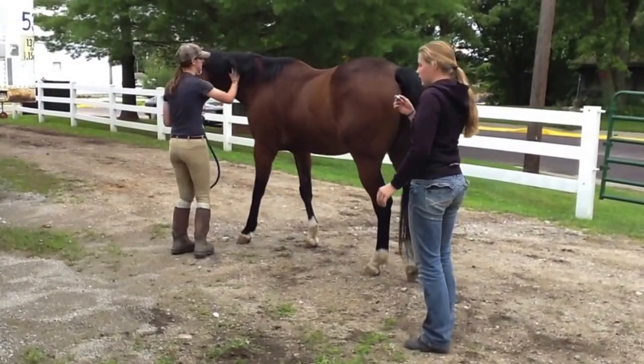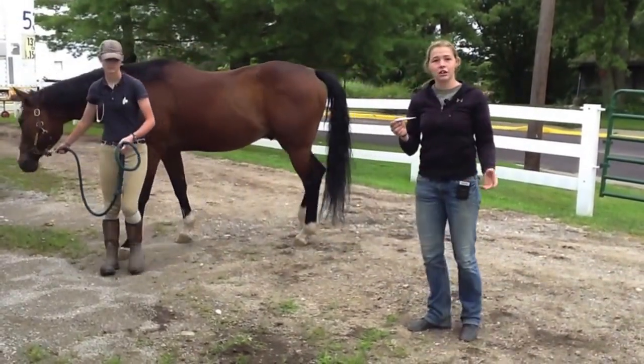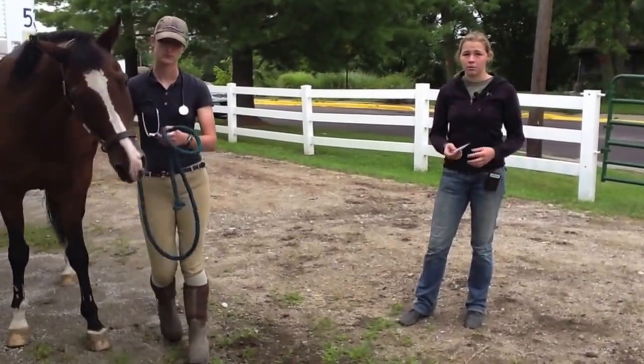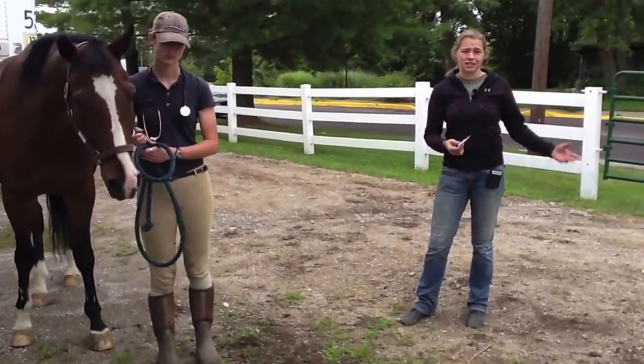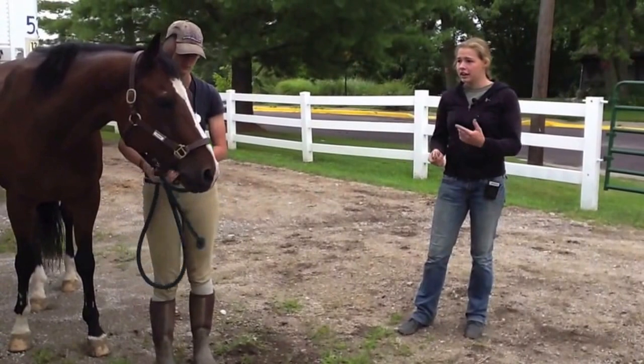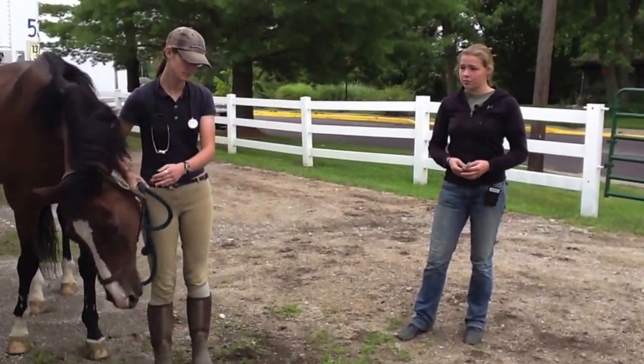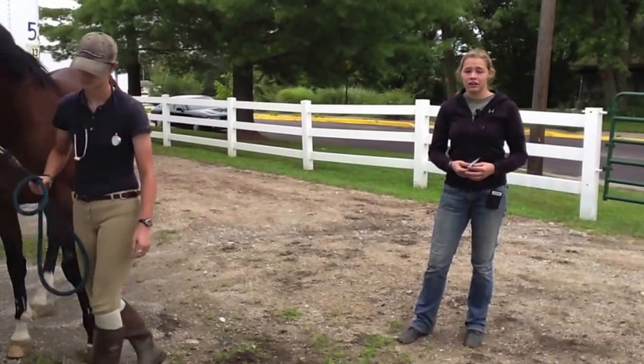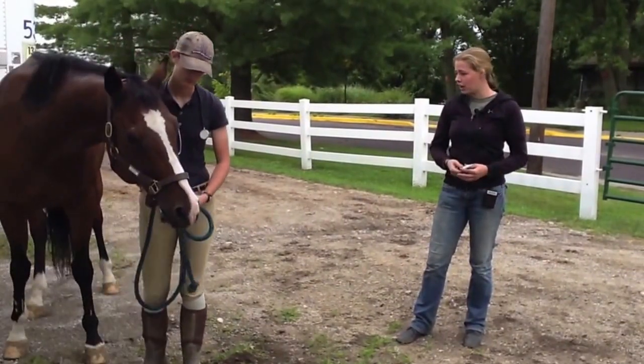Okay, so I got 99, which is a little below the normal average of 99.5 to 101.5. This could be because it's a little cooler outside. Again, same thing applies as with the heart rate and pulse. If they've been exercised or running around, that could elevate their temperature as well.